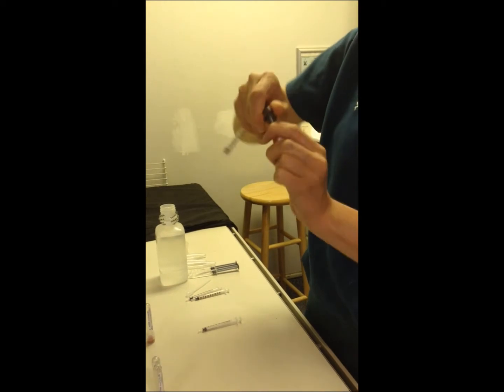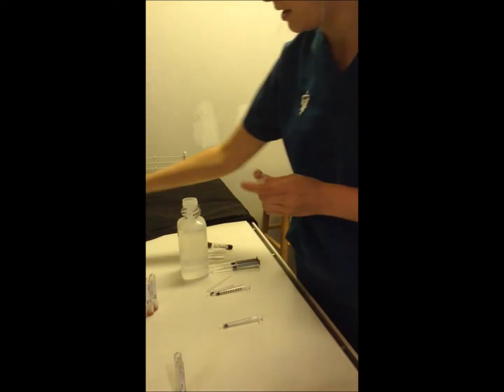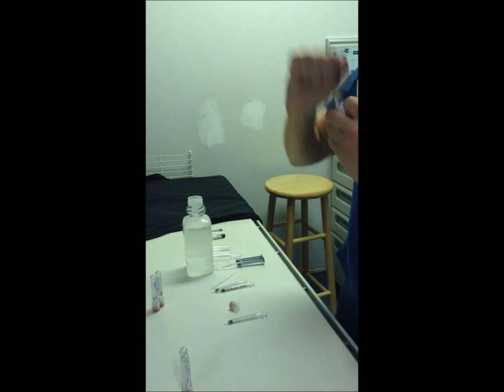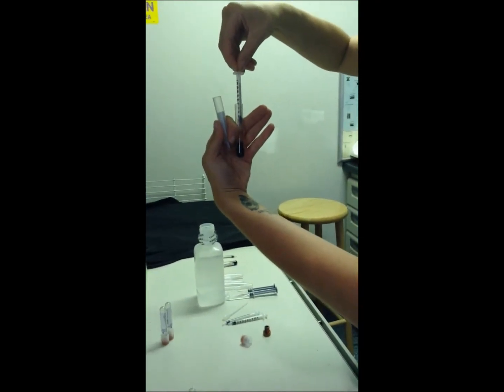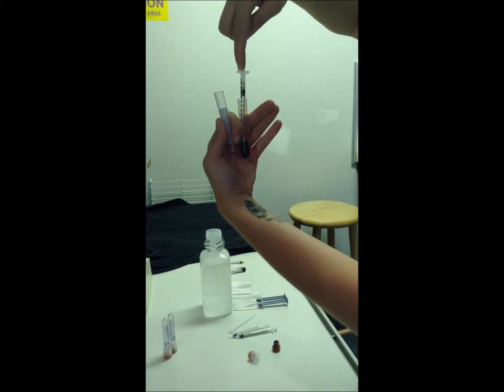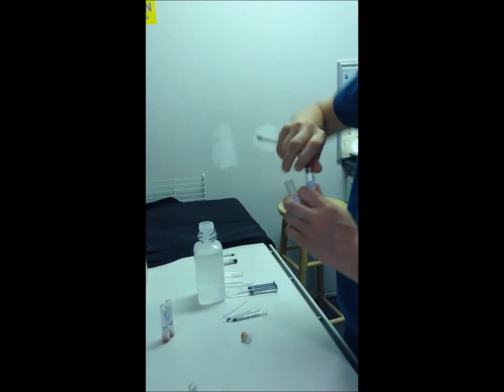And then we're going to do the same thing for the recipient, Ethel. This is her tube. Using a syringe, we're going to take the serum out. Place that into this tube, and we will put that to the side.